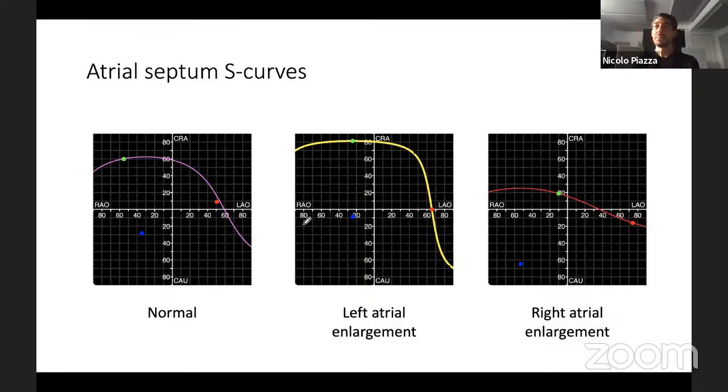what type of needle curve do I need? And am I going to puncture this from below, from the IVC going upwards, or am I going to do the traditional SVC and come downwards? And so maybe I'll do a little drawing here on the side. So if you have your SVC, you have your atrial septum, and you have your IVC here, and you get your right atrium with your right atrial appendage.